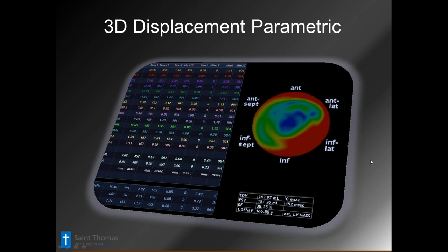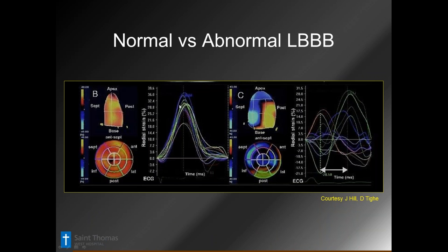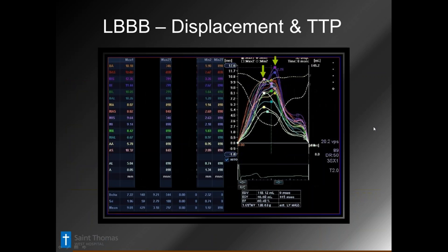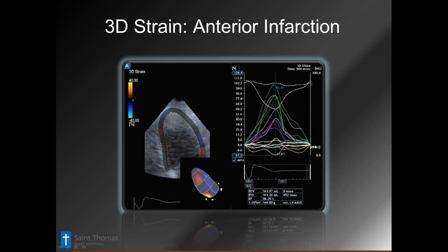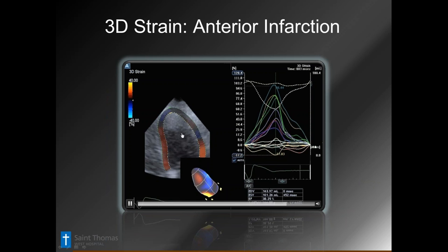From colleagues at UMass, we can also see bundle branch block very easily — here you have very heterogeneous waveforms versus when they all peak at the same time in a nice bell curve, then things get all spread out with bundle branch block. On strain imaging, if you have someone with say a 150 millisecond delay, you would see it on M-mode and also on the 3D imaging — easily seeing the divide between the inter-septal and more lateral walls.